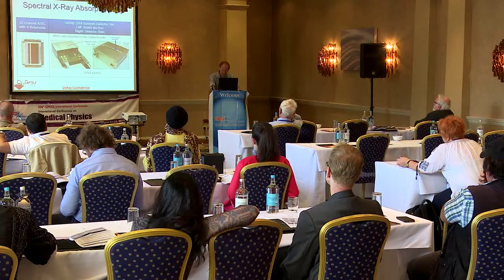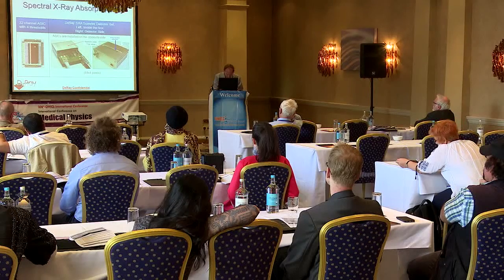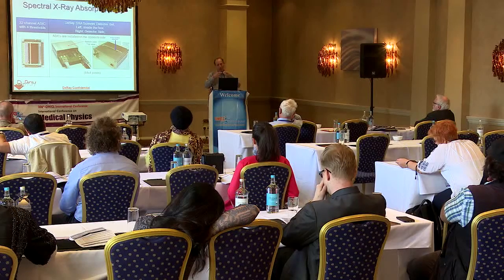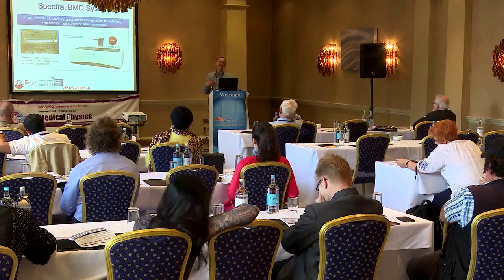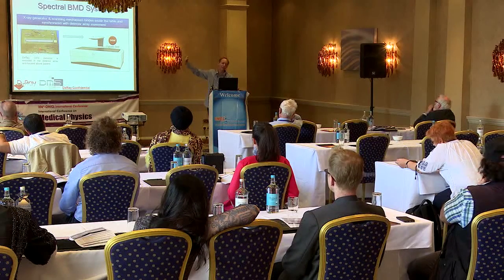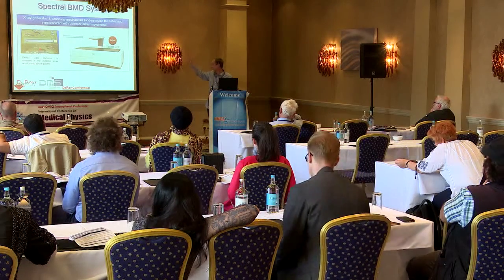Okay, and here you see a detailed picture of the ASIC, and it uses a linear array of inputs, not a 2D array of inputs as in the CT system. And this detector is in the Stratos DR system, which is provided by DMS.